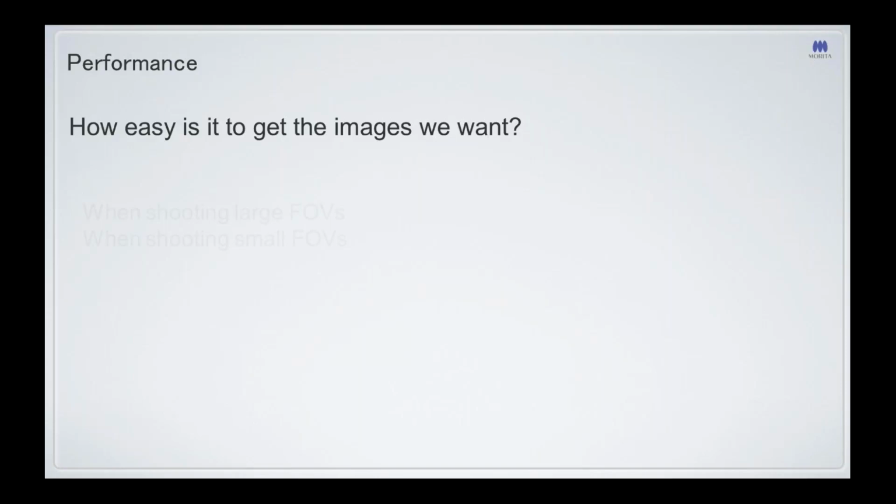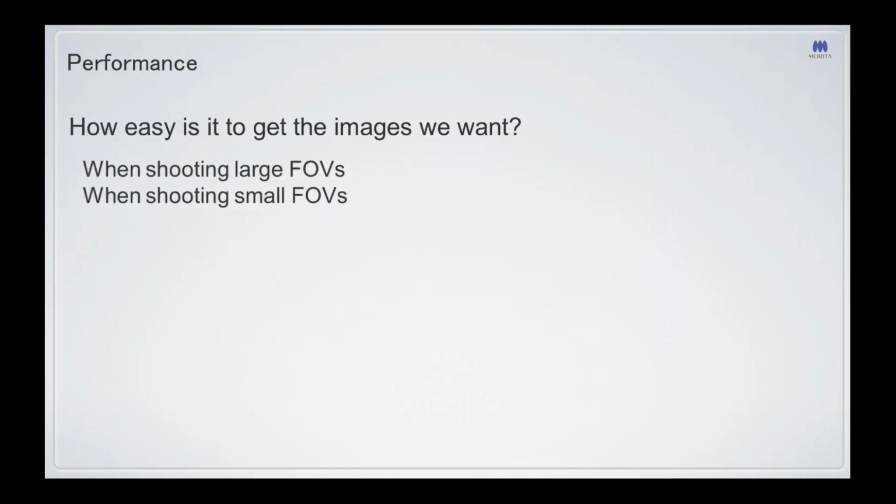There's no point in buying an expensive machine if it's difficult to use and your staff are unable to position the patient consistently. So when you're shooting large and you're shooting small FOVs, do you have capabilities within the machine to make that job easier?